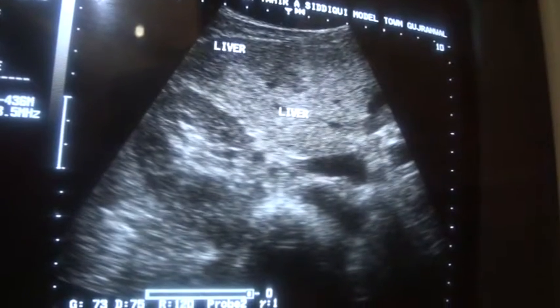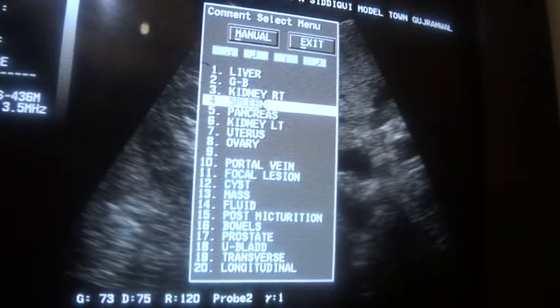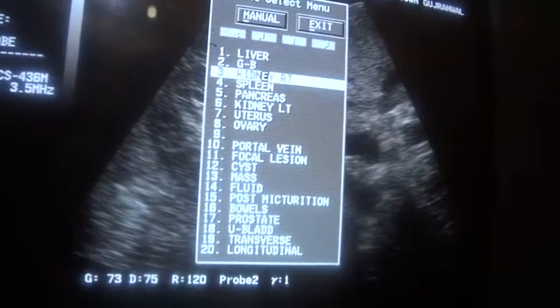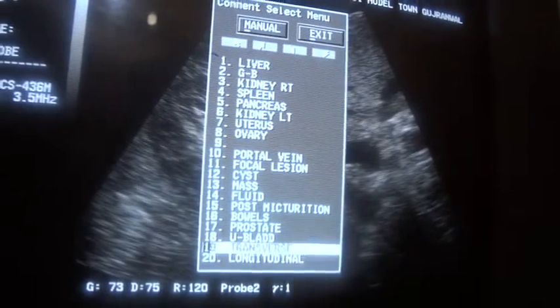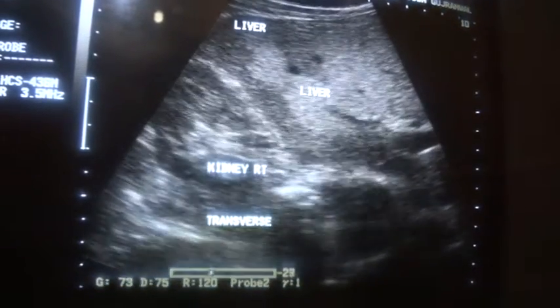Okay, so in one liver you are seeing two changes. One is normal in echogenicity and echotexture. The other is having fatty liver parenchymal changes with homogeneous texture and smooth outer surface.